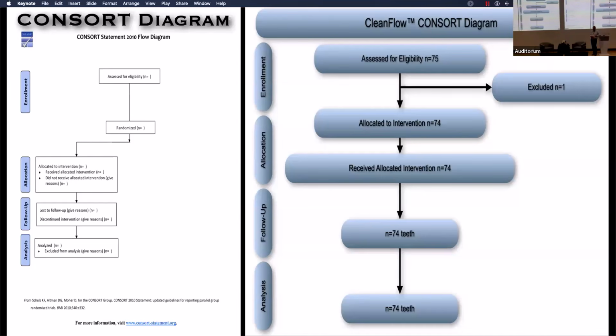I wouldn't talk you out of two visits, but I think GentleWave can be very useful for a lot of cases. Your bread and butter, like these three cases, is a dead molar through a crown. I don't even think about those anymore. Mike Trudeau and I are working on a new decision-making algorithm, loosely called advanced irrigation, about where you should do single visit and where you should do multi-visit, those kinds of decisions. I think we need to revisit that in the age of advanced irrigation now.